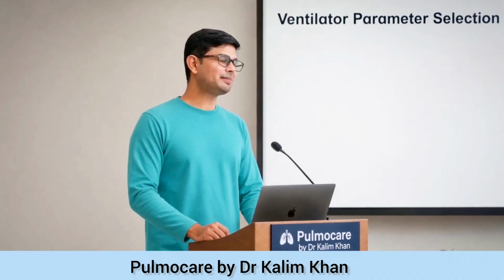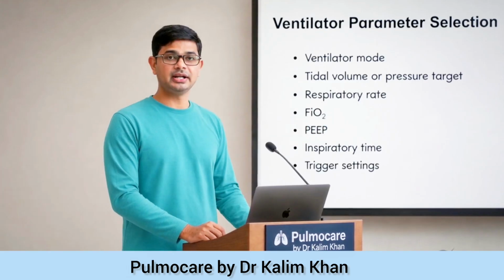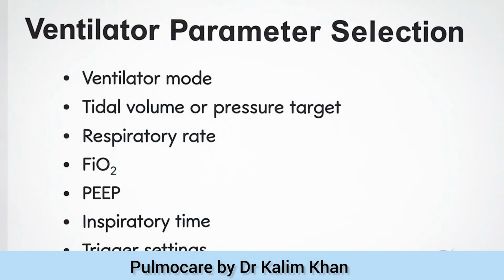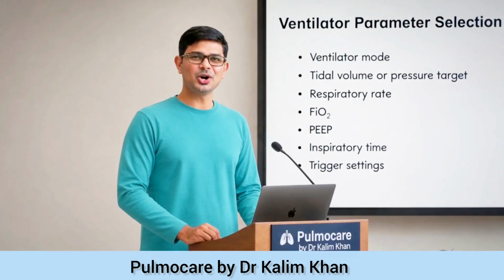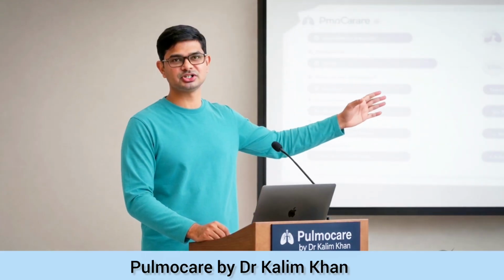Now let's come to the ventilator itself. Modern ventilators contain electronic and pneumatic systems that control the delivery of each breath. We select parameters such as the ventilator mode, tidal volume or pressure target, respiratory rate, FiO2, PEEP, inspiratory time, and trigger settings. Each choice is critical for patient care. The ventilator uses these settings to generate and control the patient's breaths.